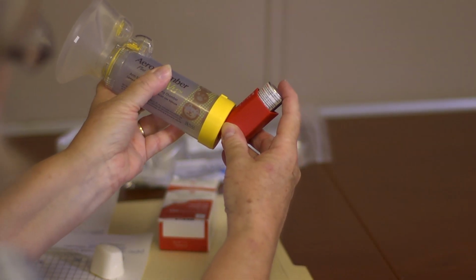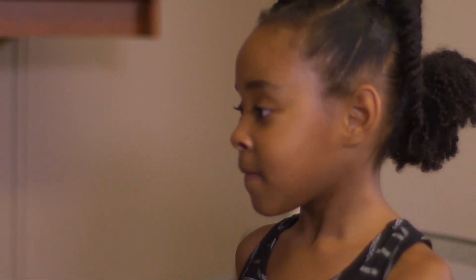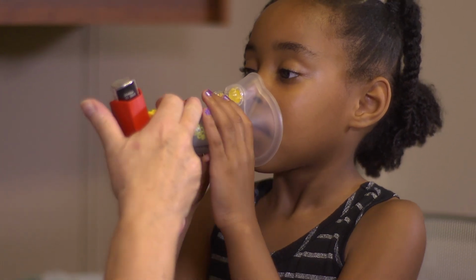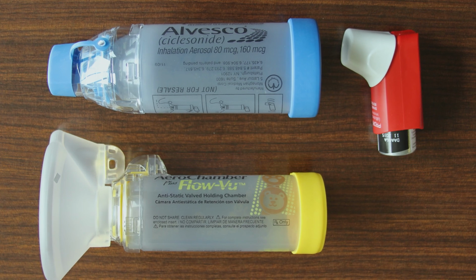Place the inhaler mouthpiece onto the end of the spacer. Hold the inhaler between your index finger and thumb. Have the student stand up and take a deep breath in and breathe out. Place the spacer mask over the student's mouth and nose. For older students, spacers without a mask may be used. Follow the individual spacer instructions.